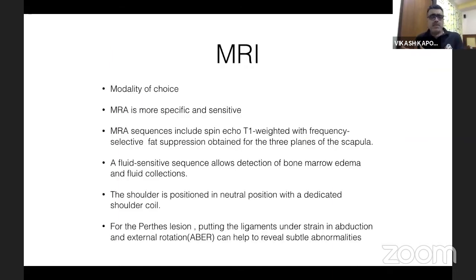After the CT scan, we come down to the investigation of choice today, which is the MRI. It is the modality of choice. It has led to an understanding of instability in ways which had not been understood earlier. There can be any number of lectures on this particular subject, but I would keep it restricted to a small number of slides to understand the basic and main things.